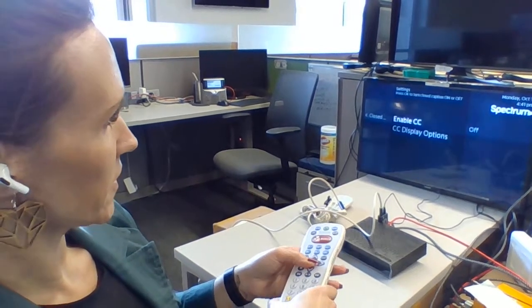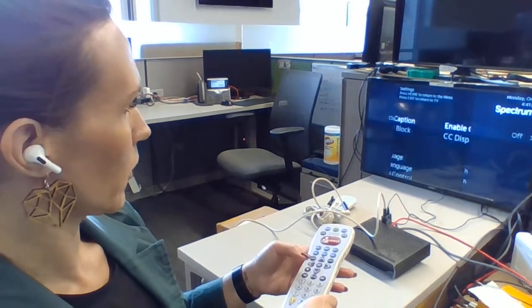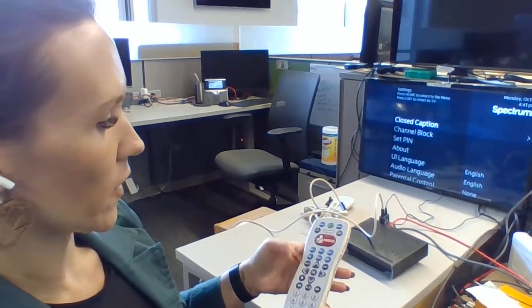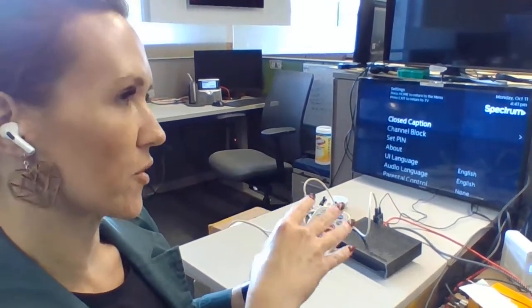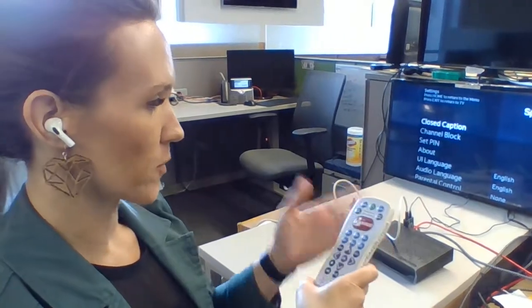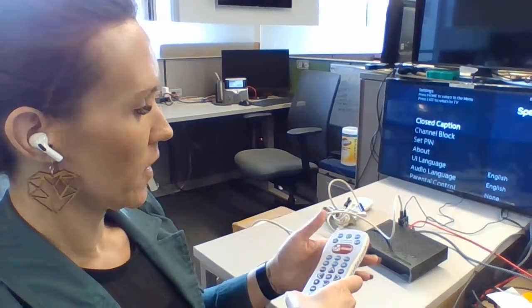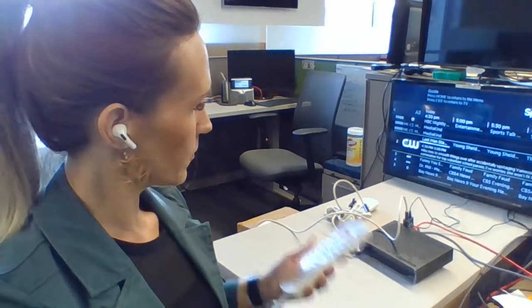We're also able to do closed captioning. One good thing about this is with closed captioning, the closed captioning font can be increased larger and darker, but that's part of the UI that's separate from this. So I'm just showing you the pillow speaker interface. That pretty much sums it up — if you have any questions, let us know. Thank you.